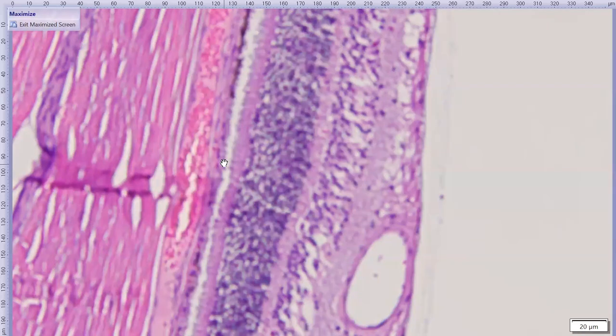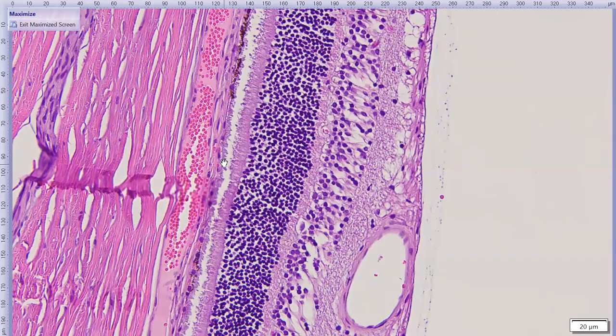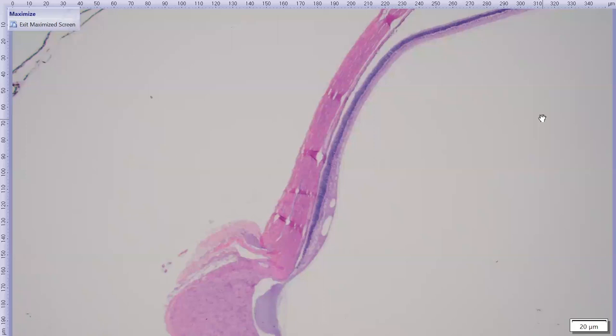However, when you look closely at this retina, even in the central retina, there are basically no retinal ganglion cells to be had. So those are all gone. And this is the typical presentation of a chronic glaucoma in a cat retina and optic nerve. So we've got the cysts, we've got a bit of dyscoria, and we've got a glaucoma.